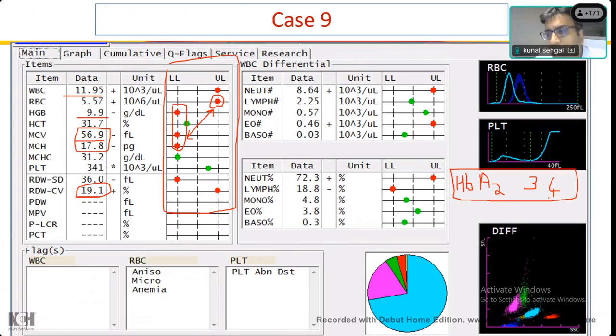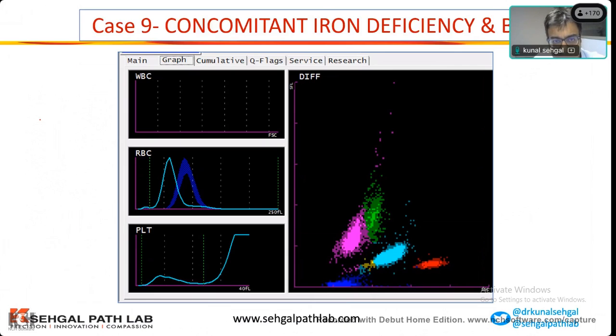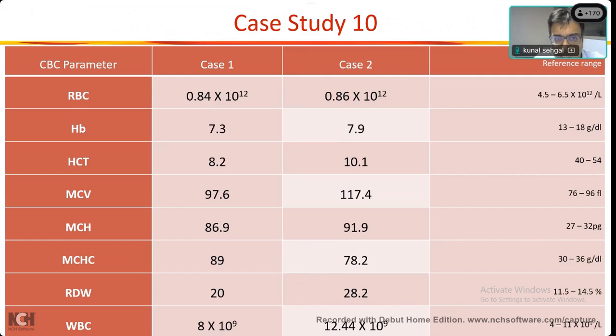Suppose the patient has already done it. In an iron deficient patient, if you see an HbA2 level of above 3, even if it is 3.2, always advise repeat HPLC after hemoglobin normalizes after hematinic therapy. We have seen patients whom we falsely labeled as not thal trait and they turned out to be thal trait later, because it was diagnosed after iron therapy. Obviously, family history is useful. So this patient was concomitantly iron deficient.